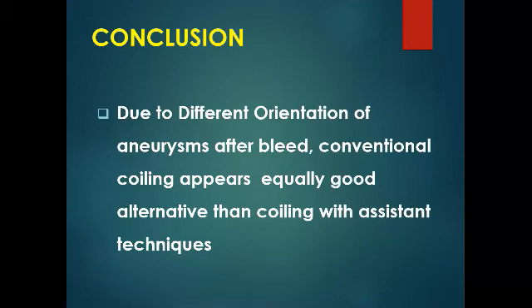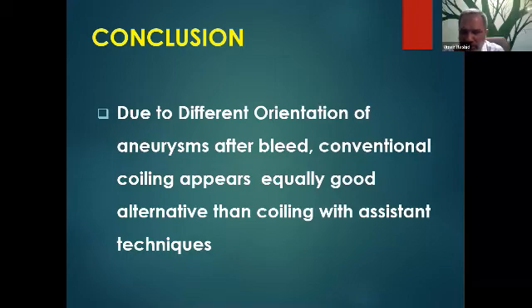Yeah, I'm very impressed with the shapes. I'm just wondering, are all of those patients you treat ruptured patients, or do you mix ruptured and non-ruptured together? And is there any kind of difference in the management, do you build up your endovascular technique depending on whether the patient is ruptured or non-ruptured? In fact, we were treating both ruptured and unruptured. But sometimes, as in the literature, if it is less than 4 millimeters, I don't touch it if it is not ruptured. But recently we have had a bad experience with 2 or 3 cases which we didn't touch, less than 4 millimeters. They ruptured after a few months.